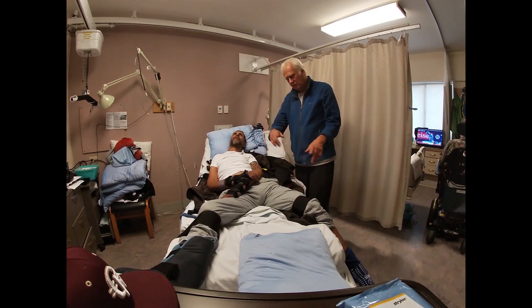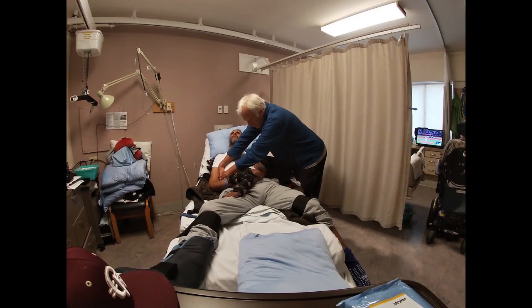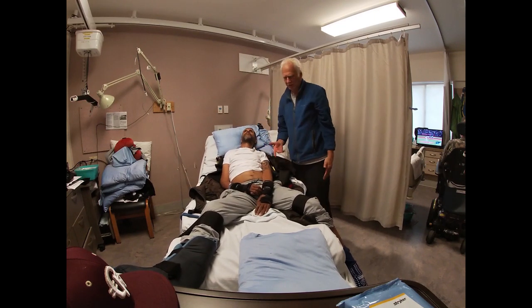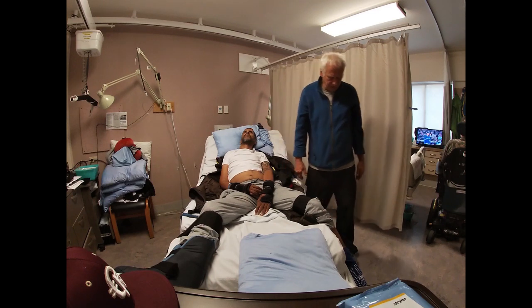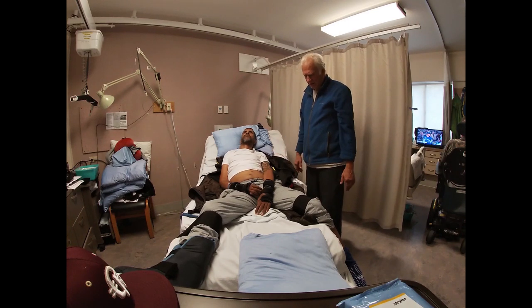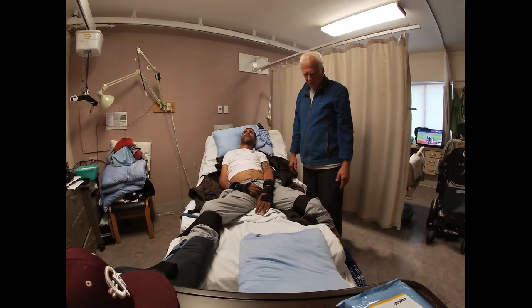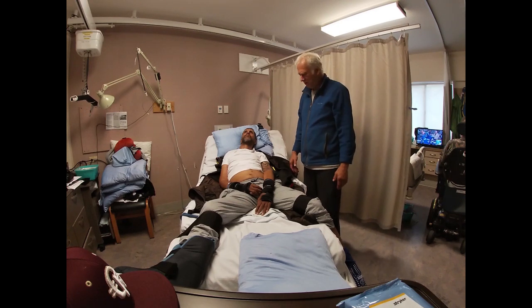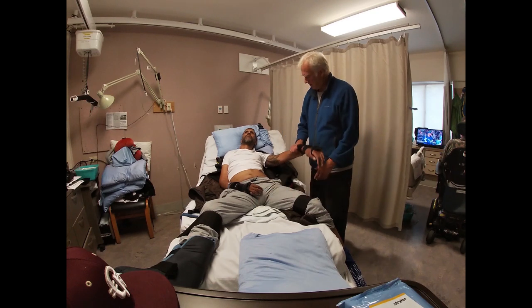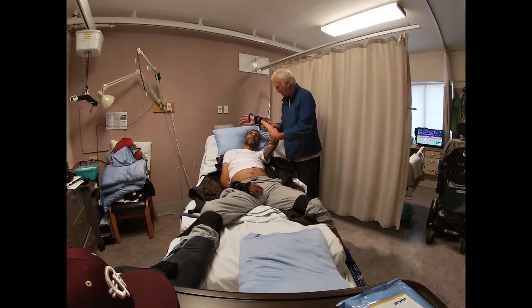So in this case here, without strapping the legs to the side of the bed, I would not have been able to move the arms over his head. And also by moving his torso like this, that would have gone into spasm again, same way. So, very simple solution that has a profound effect, and I'm glad I discovered that Corey responds well to this kind of work. So in future, if anybody's working with him, try stretching out the hamstrings first, and then strap his legs to the side of the bed, and then you can work his arms and shoulders really easily.